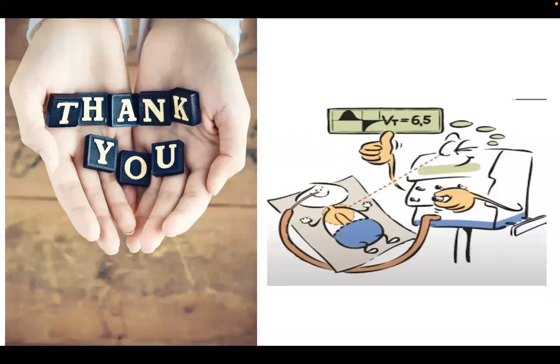Because in high frequency ventilation also, the volume plays an important role, the fluctuation of volume will be less. Some of the newer modes of ventilation like SLE 6000 actually use this volume guarantee along with high frequency ventilation. The second important question, I think someone has asked, is any experience with cuffed tube and VG?